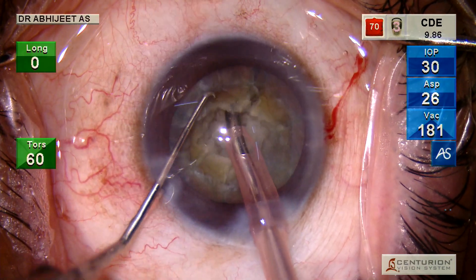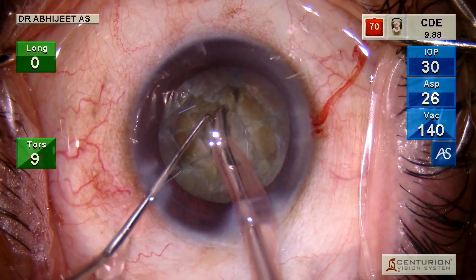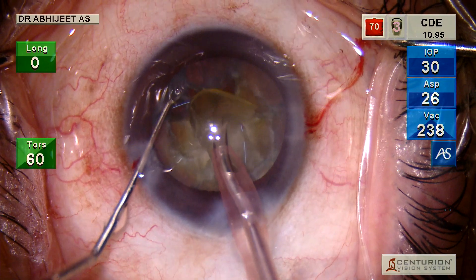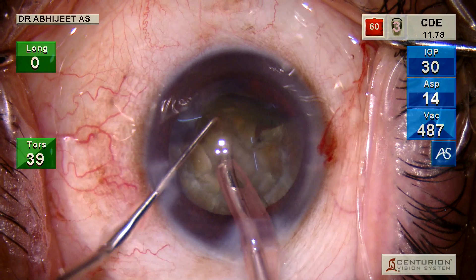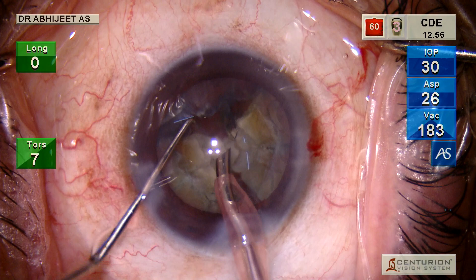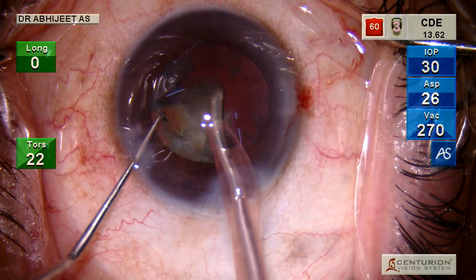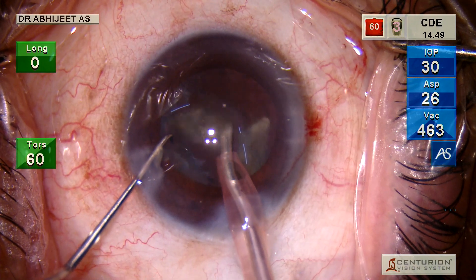You need enough vacuum to hold the piece — you need not always achieve full occlusion, but if you have not held the piece properly it's just going to eat through and make a cavitation. If you realize, I'm not allowing the pieces to occlude my tip because I want to use the Ozil to its maximum efficiency.